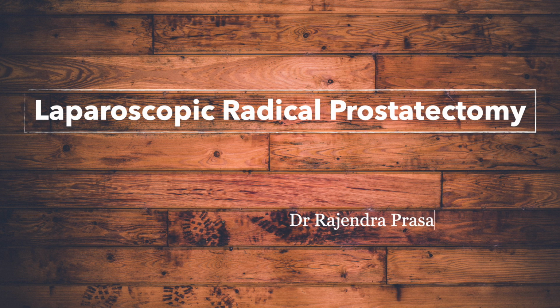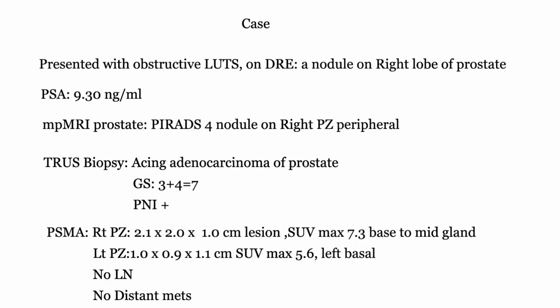Laparoscopic radical prostatectomy is a complex surgery. Here, I am trying to describe it step by step. This is my case, a localized prostate cancer. Gleason score is 3 plus 4 equal to 7.